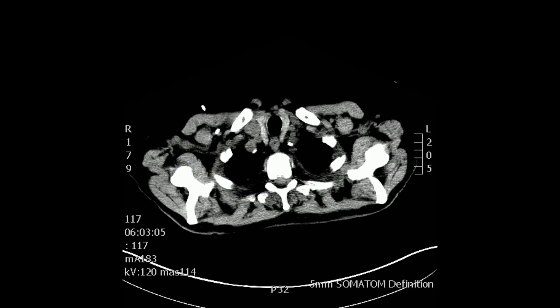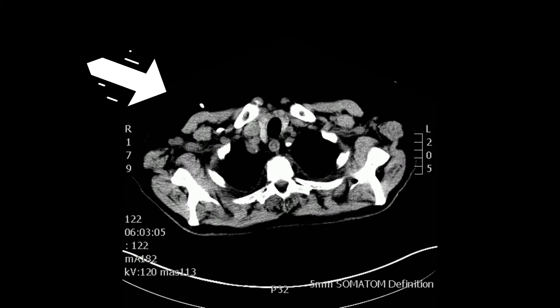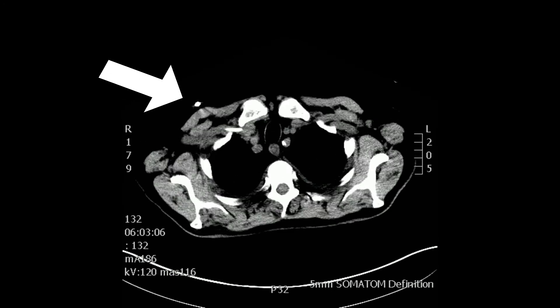This patient also had a mediport, as shown by the large arrow, and the small arrow shows part of the mediport. You see both carotids, left and right.